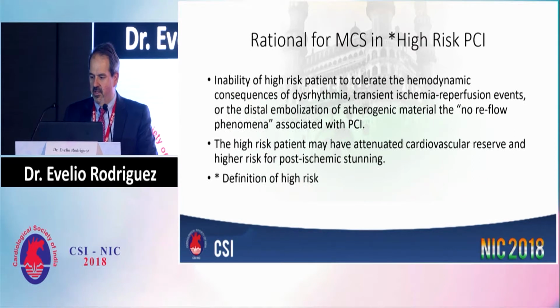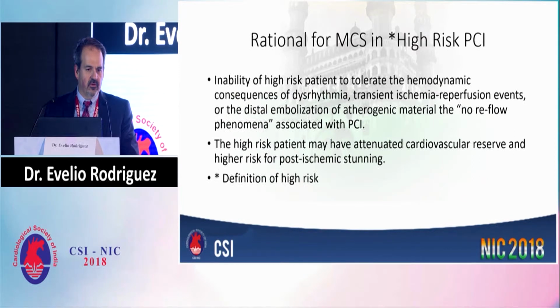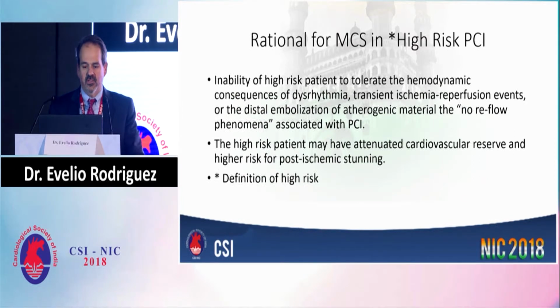So really, the scope of this talk is just to go over some of the mechanical support devices that are available for high-risk PCI, whether it's CHIP, whatever you want to call these procedures. And I think it starts with what is the rationale for this.